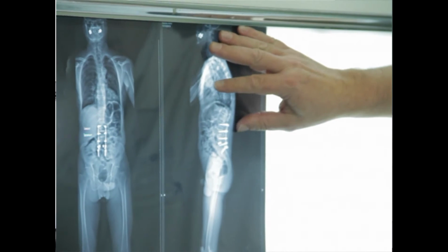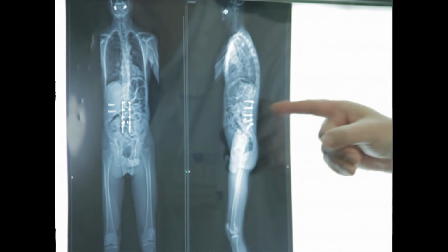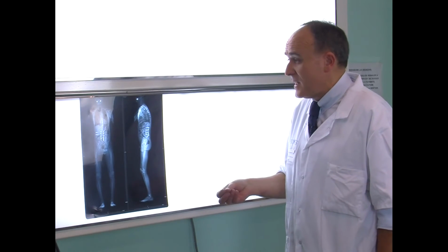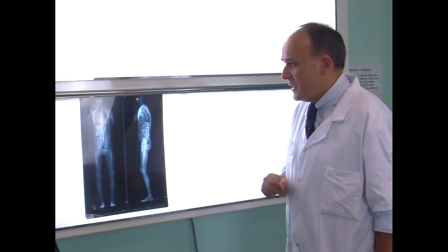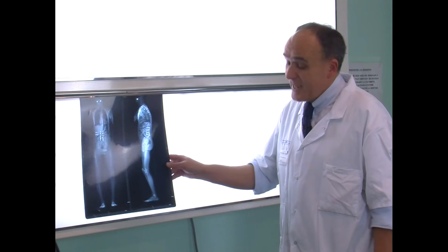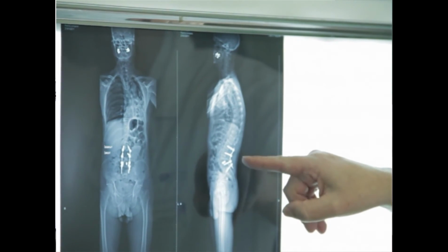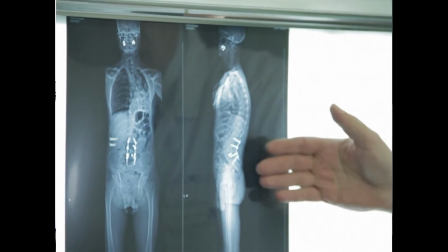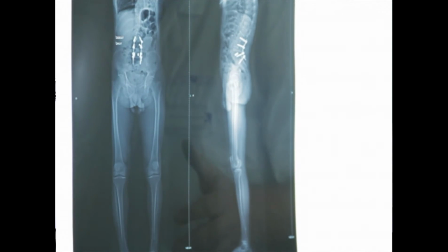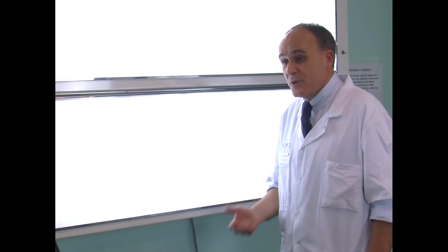This man was operated, he had the previous posterior fusion, and you see that he has imbalance. Is it due to the spine, to the hip flexum, or to the knee flexum? You have to discuss with him to convince him to do the correction at the spine level. With those images, it is very easy to explain to him the global situation. It is also very easy to explain to him the final result. You see, we did only the spinal correction, a wedge osteotomy, and you see that this spinal correction induced a correction of the lower limbs, doing nothing on the lower limbs. So it's easy to explain previously, but also to explain the result postoperatively.